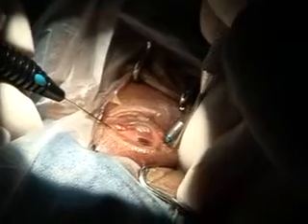Laser. Attached retina is lasered with great maneuverability since a laser probe is built into the microendoscope probe, and a direct endoscopic view avoids multiple interfaces and corneal haze, and gives a direct view of the laser aiming beam and laser reactions. Substantial differences between endoscopic and conventional microscopic view and instrumentation create a steep learning curve.